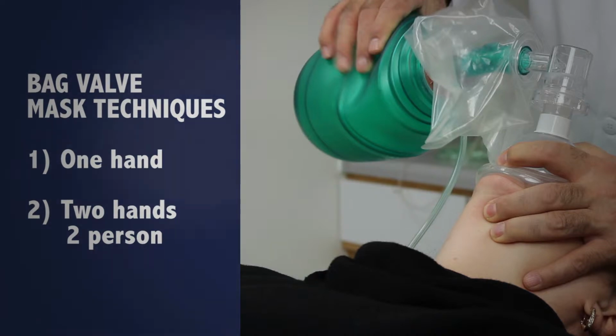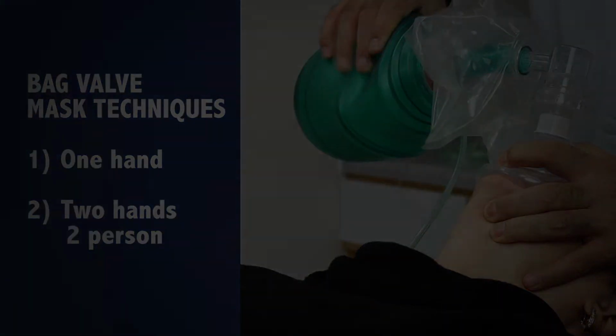Let's look at a few techniques that we might use. The one-hand technique, also described as the CE technique. This technique can be a little difficult to master, and for most of us, the two-handed technique will give us better results.